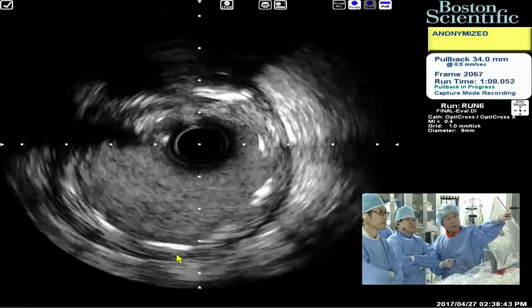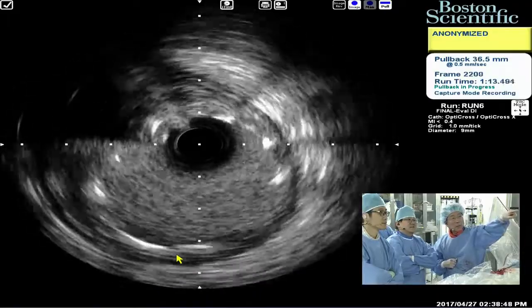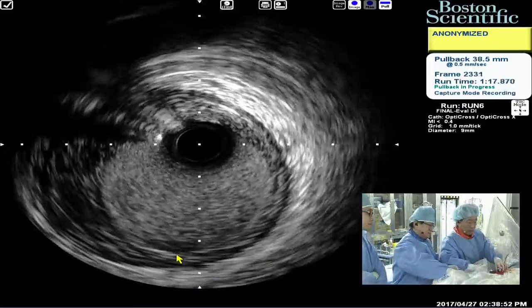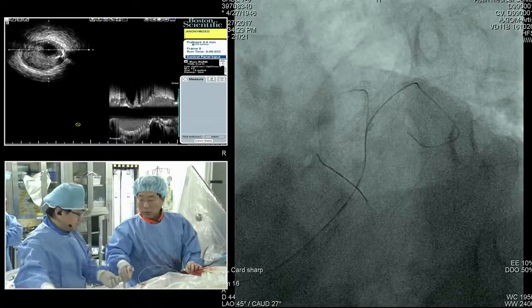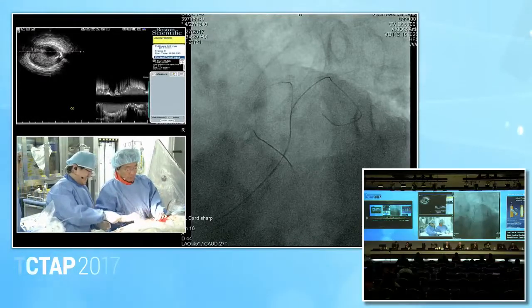Akasaka, you mentioned about the 9 o'clock something? It's okay now. All right. Two balloon, right? Bigger balloon inflation. So, very nice. All right, so we're going to show in the diagonal branches. You have two diagonals. Yes. Diagonal.